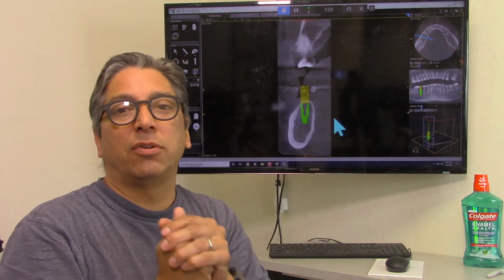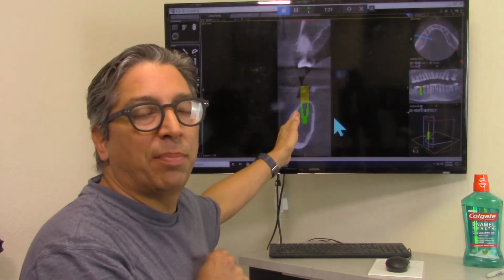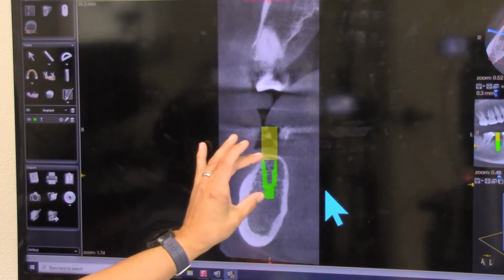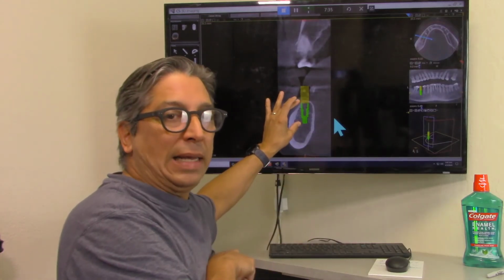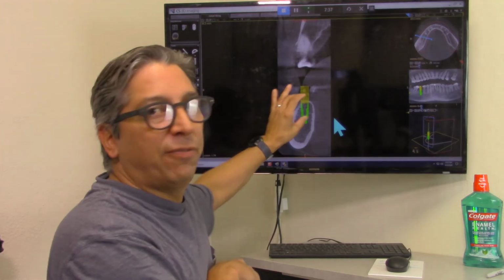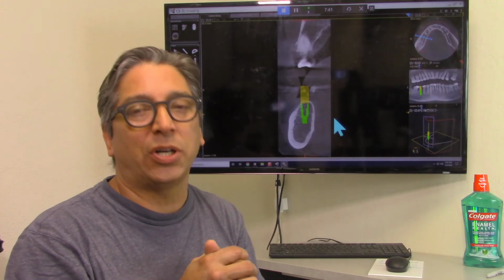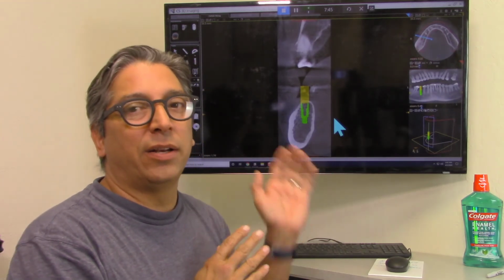And I've even talked to an oral surgeon. He was saying what you could possibly even do is open that up and mix some of the bone that you just drilled out with a graft material and then condense it back into the site. I'm not a big fan of taking stuff in and out because the oral mucosa has a lot of bacteria, and I don't like inoculating bacteria into the mouth like that.